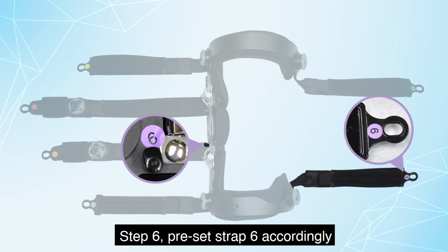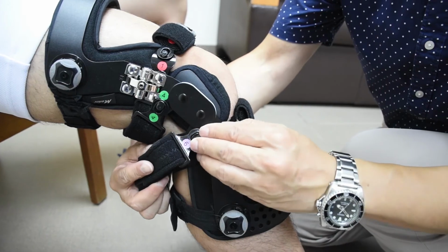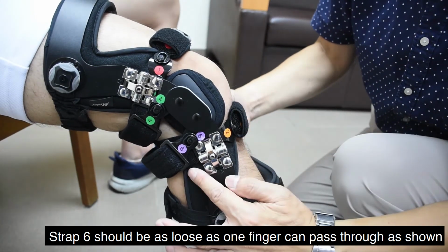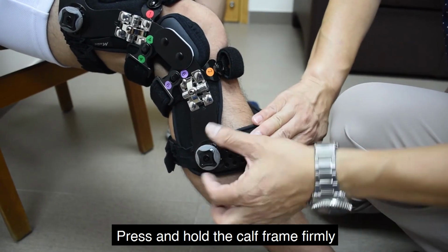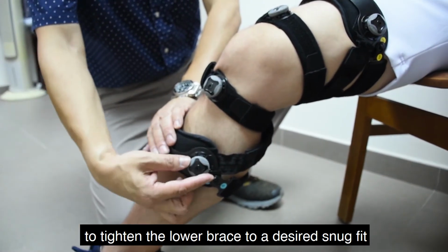Step 6. Preset strap 6 accordingly. Strap 6 should be as loose as one finger can pass through as shown. This is for convenience of subsequent fitting and buckling up. Press and hold the calf frame firmly. Press and turn the two cinch devices to tighten the lower brace to a desired snug fit.